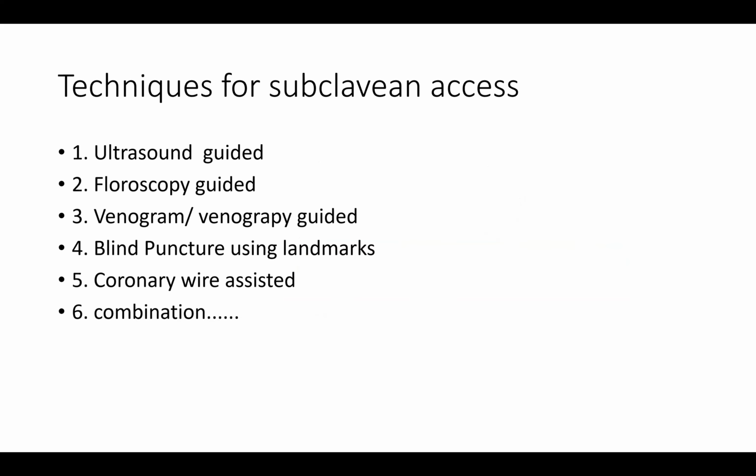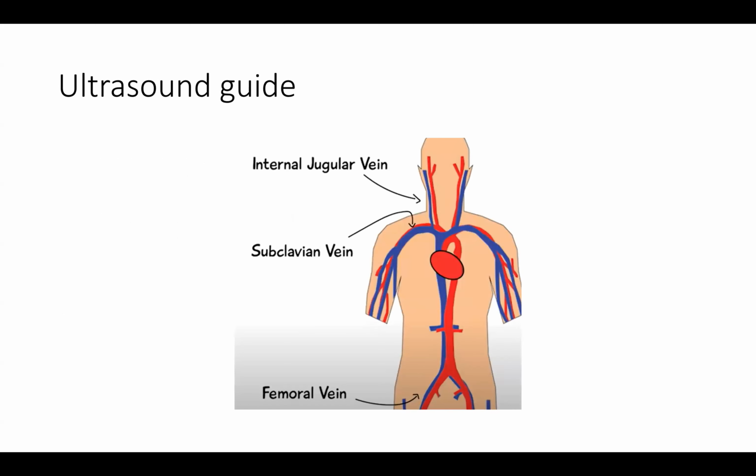Now, what are the techniques that we use as we're now coming back into access for cardiac devices? What are the techniques that we can use for cardiac devices? I will start with the ones that we don't use commonly here, then end up with the one that we use commonly here. Now, number one is ultrasound guided. Ultrasound guided is a key thing. Let me just show it here. I listed about 6 of them.